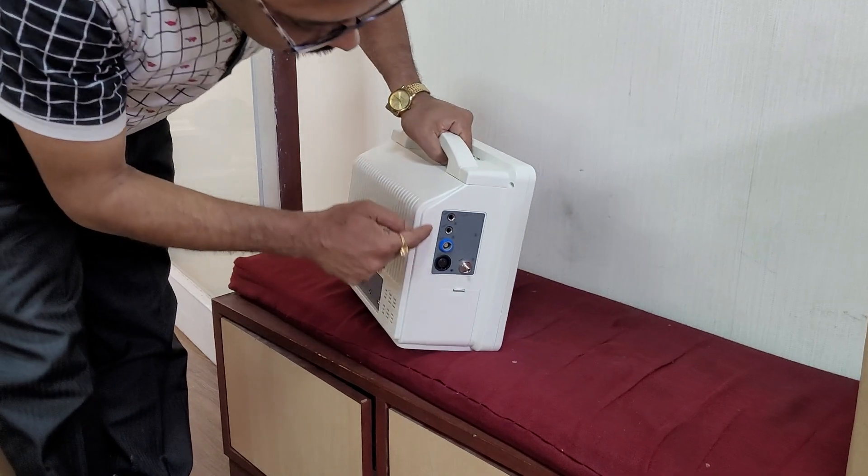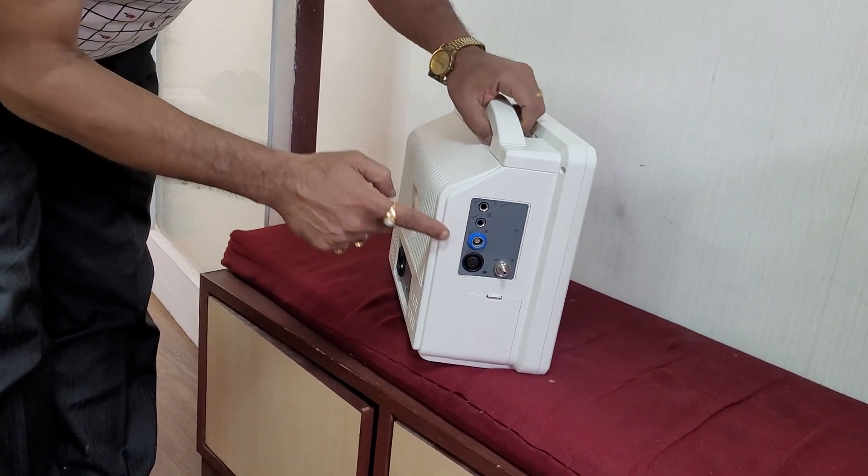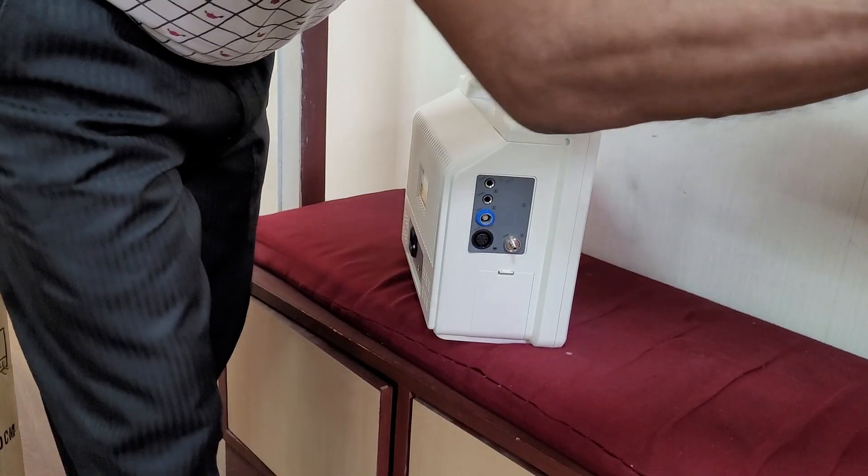This is the box where you can connect every accessory. Now which accessories you are connected in that part, I can show you.